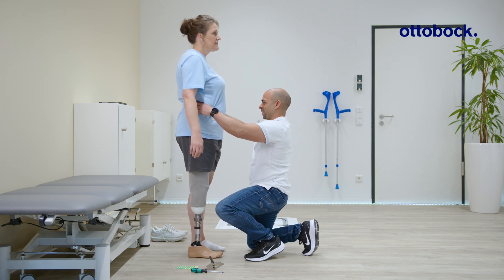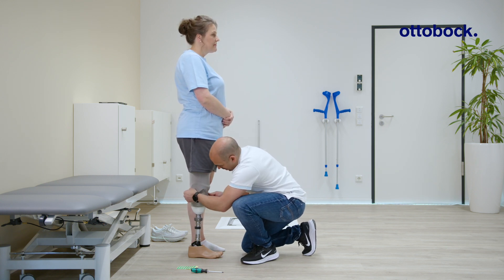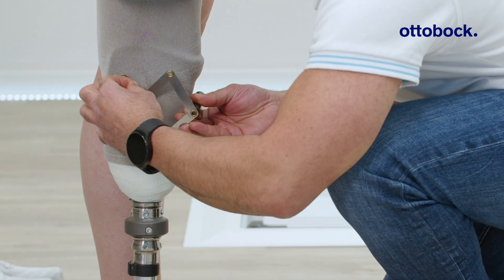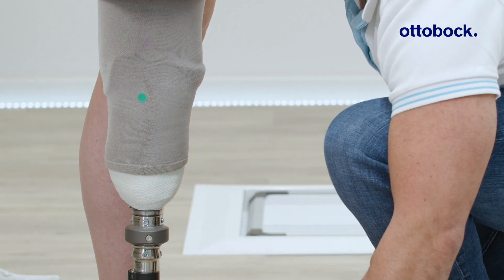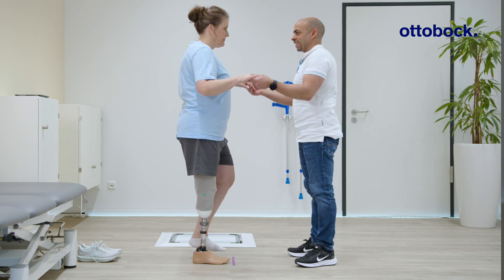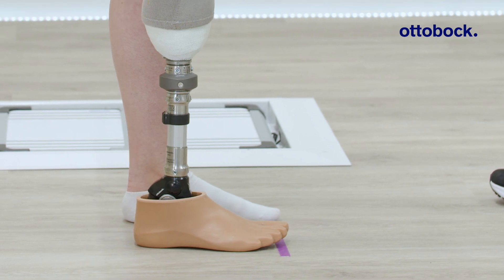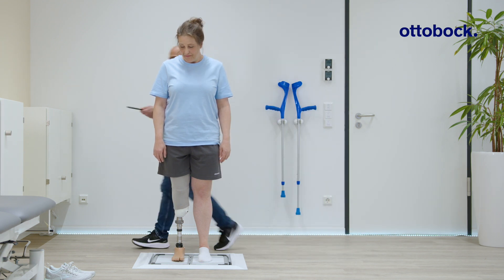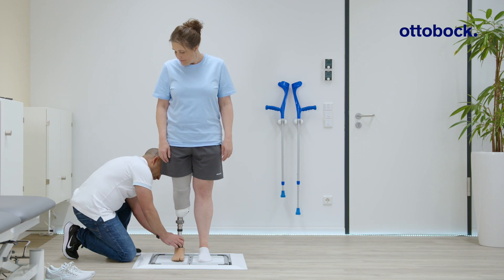Verify the length of the prosthesis. Then determine the effective knee center of rotation and mark it on the outside of the prosthetic socket. Make sure that the toes of both feet line up before proceeding with the measurements on the 3D Lazare posture, barefoot and at maximum dorsiflexion. Optimize the alignment based on the standard Lazare posture recommendation for transtibial and transfemoral prostheses.